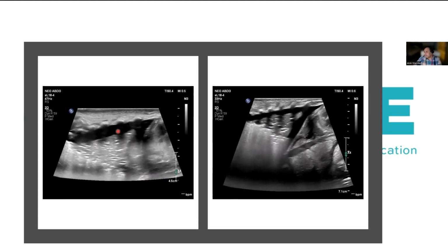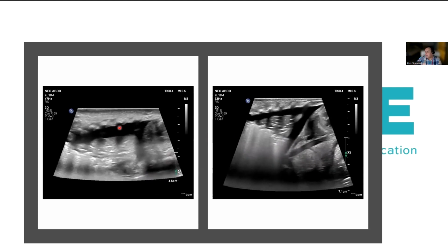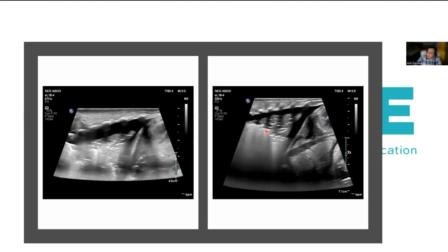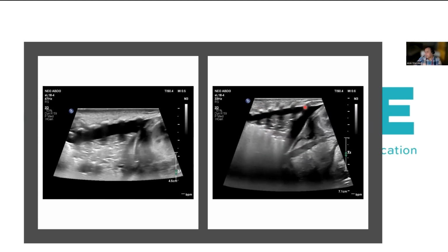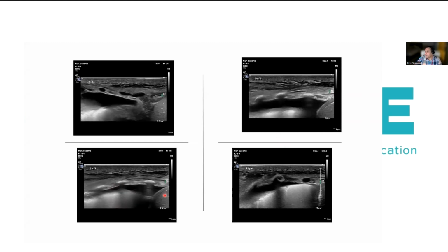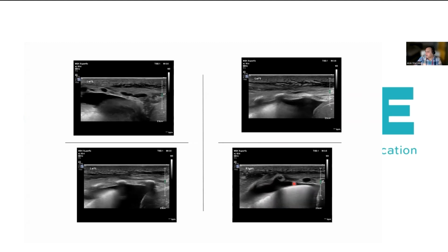But this is a diagnostic paracentesis before and after. And clearly, from my perspective, I've done it and I've tapped, but without wanting the lung to come completely to the margin, to avoid puncturing the lung. So again, it's really safe to do a diagnostic butterfly paracentesis without puncturing the lung, because you can actually monitor the volume of fluid in the lung appearance. Very similar appearances where we've done a diagnostic paracentesis, and clearly what you can see is, you stop once the lung margin comes really close, to avoid puncturing the lung.